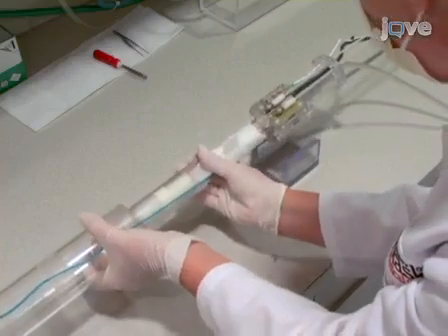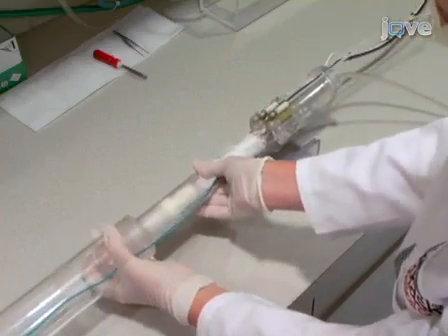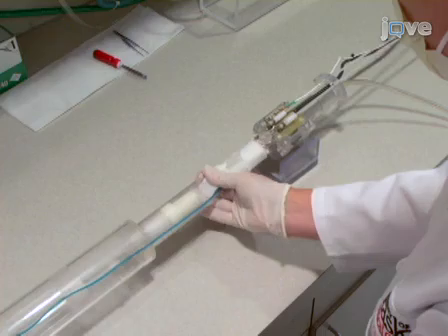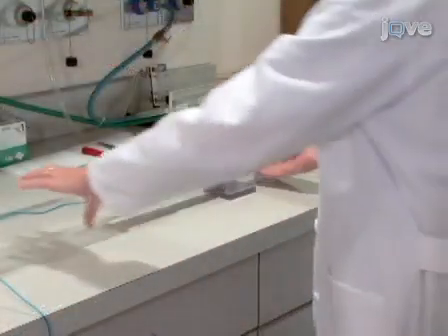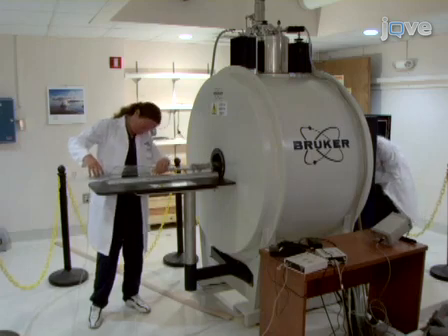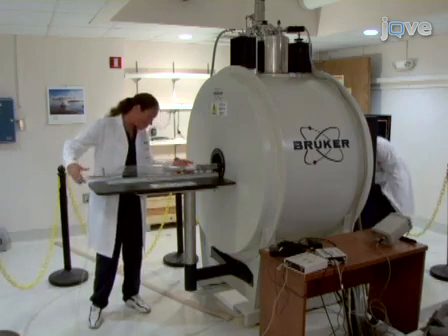Allowing for rotation of the animal holder when in the magnet will provide compensation for minor rotations, which may occur from animal to animal. Once the animal is secure in the holder, place the holder in the MRI scanner. Now, move the holder with the surface coil into the center of the scanner.